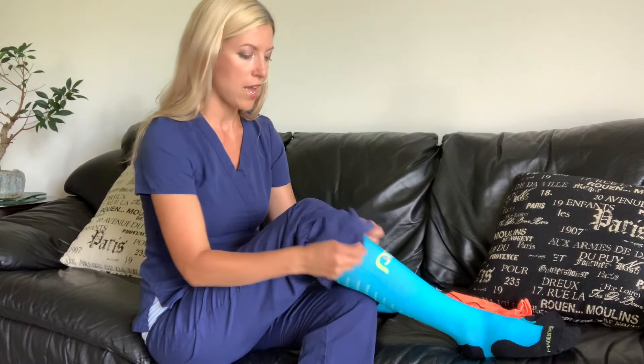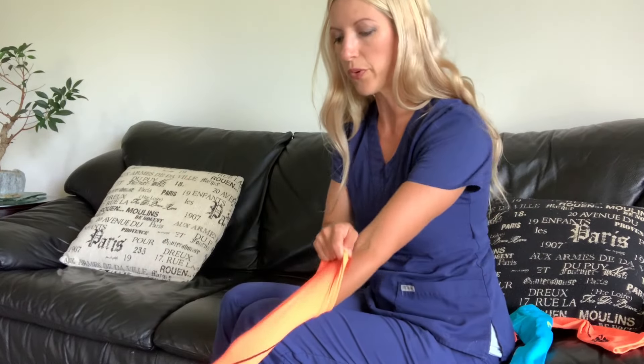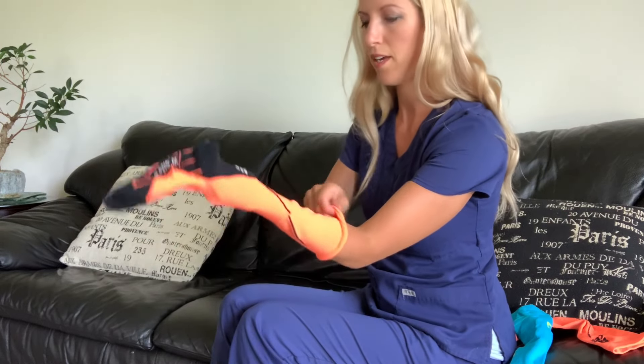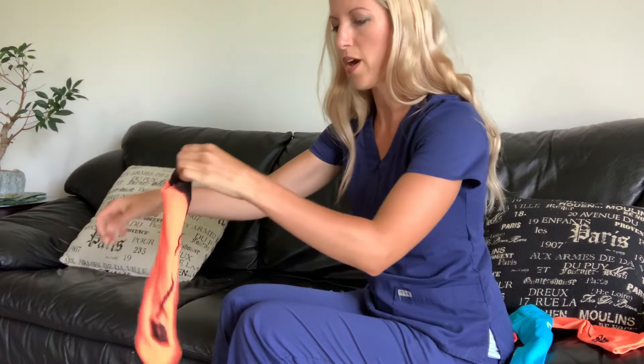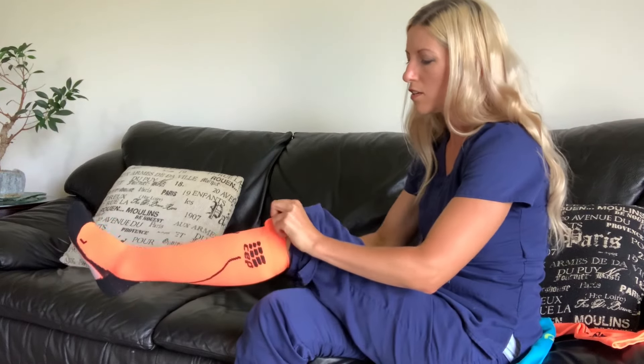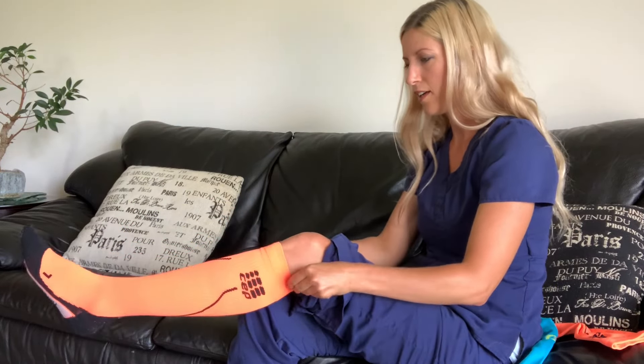Now I'll do the CEP brand of compression socks. Same thing — reach in, grab the heel, pinch it, and pull the sock over top so you have a little booty on the inside. Then slip it on like a little anklet sock. These ones are definitely much more snug — I can feel it just putting them on. You can work the rest up, and as you can see I'm having to put more effort into pulling these up. There is a noticeable difference. Right up below the knee, about two finger widths behind the knee — and this is the CEP brand.